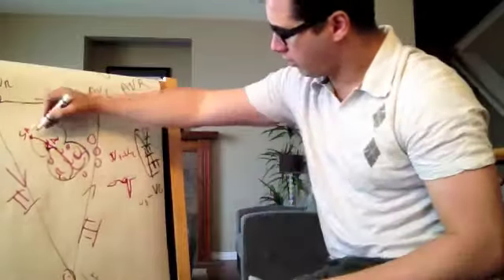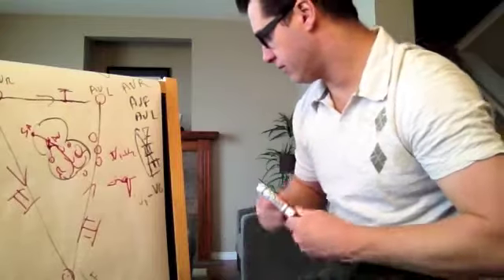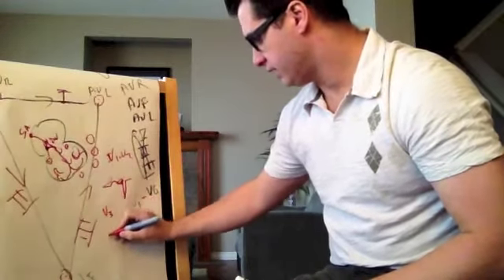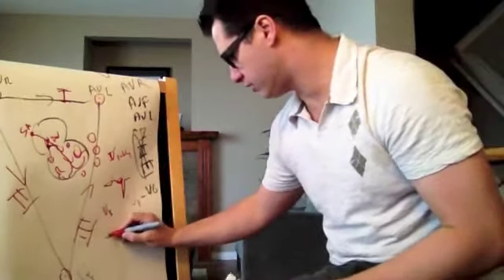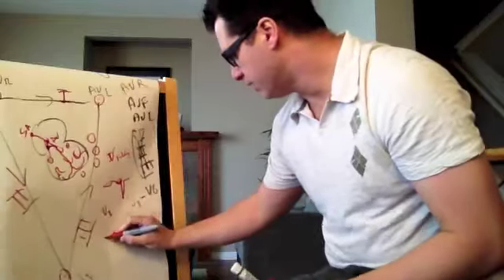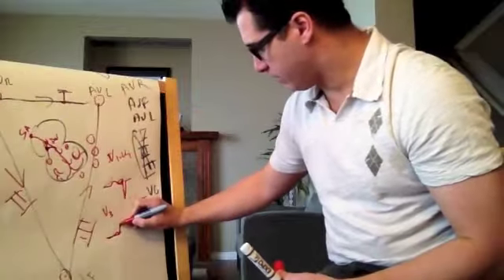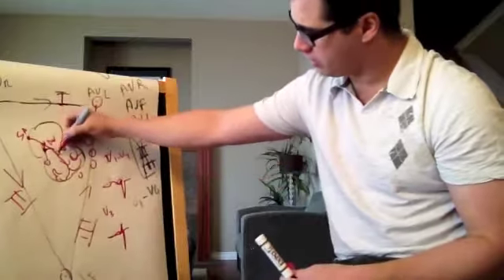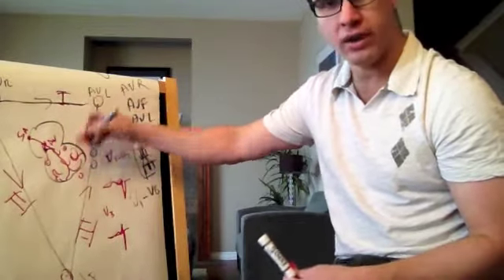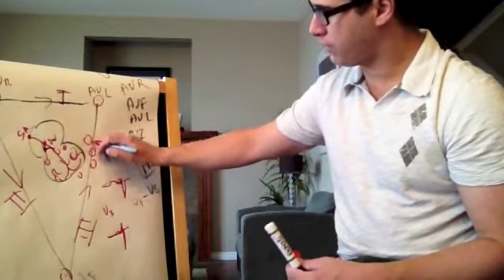Okay, so all this time that electricity is going towards me, let's do it in red, so that's V3. As electricity is going towards me, and I won't do the P wave anymore, I'm just going to do the QRS, it's just to understand that concept. So it will be positive as it's coming this way, but then it will go negative. So a little bit more positive than V1, V2, because all this distance where it's going to go towards it, but still will be mostly negative, because then between V4, V5, V6, all the electricity will be going away.